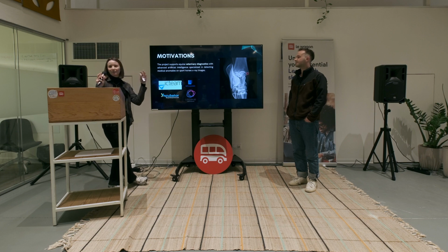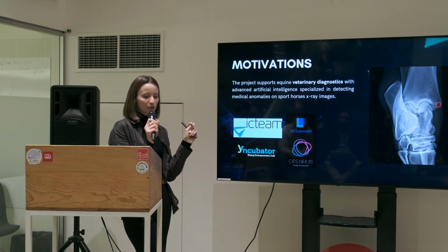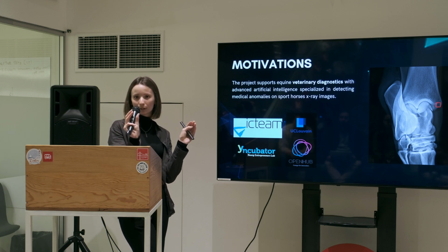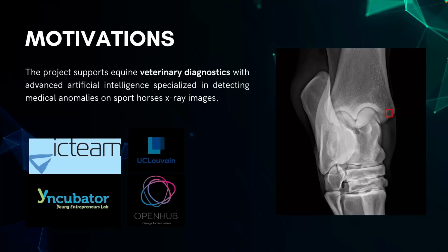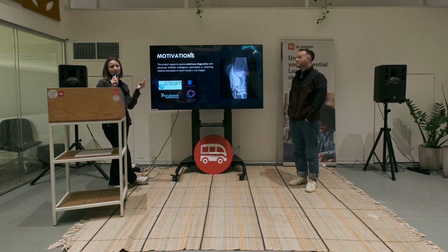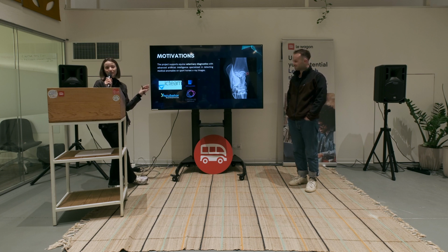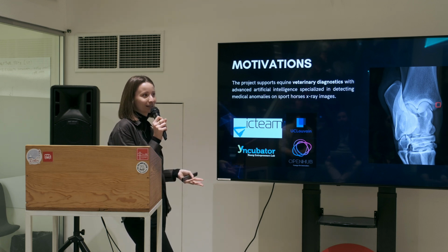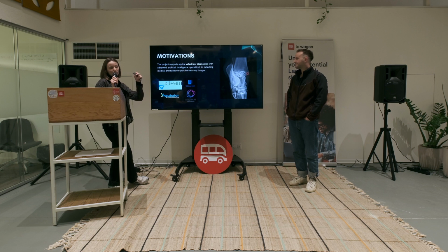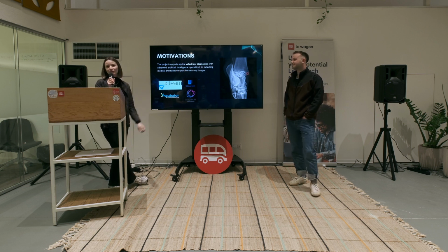So basically, the pipeline of our work is that first we decided to compare the unsupervised learning method with the supervised learning method that we're gonna tell you more about in a few minutes. Then we did some label extraction with the Google Gemini AI of 30,000 consultation reports from real patients. Then we did convolutional neural networks, which is basically just classifying the images from fractures to non-fractures. And finally, our last model is a model able to highlight the pixels of the X-rays that were very important for the classification. And with that, we were able to retrieve the localization of the anomaly.